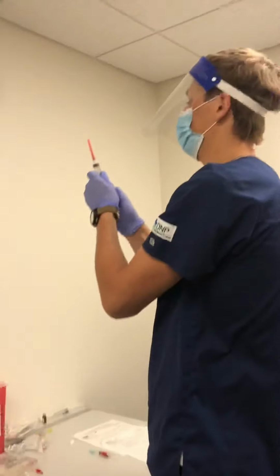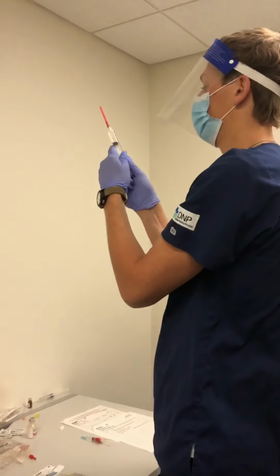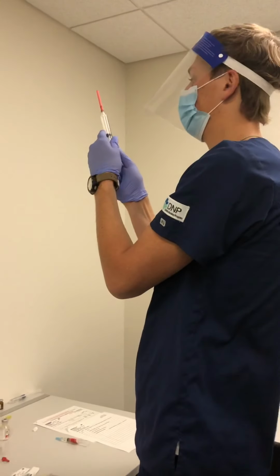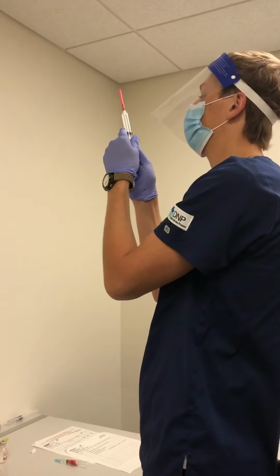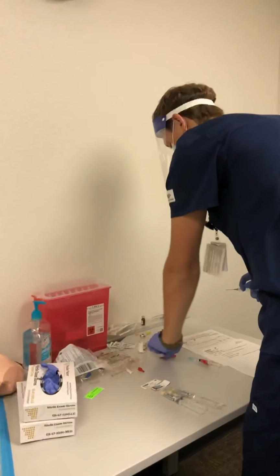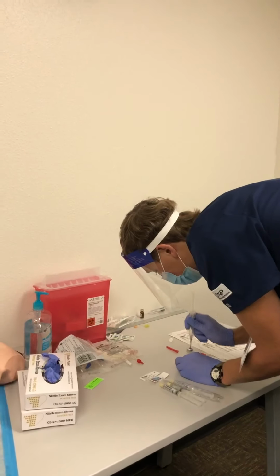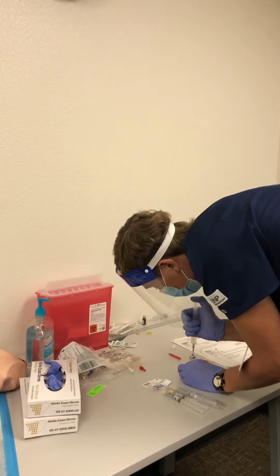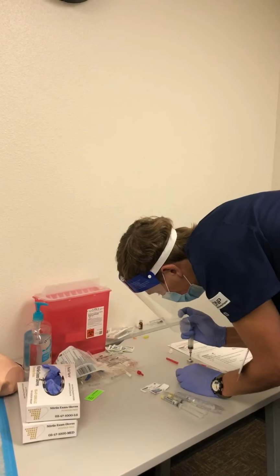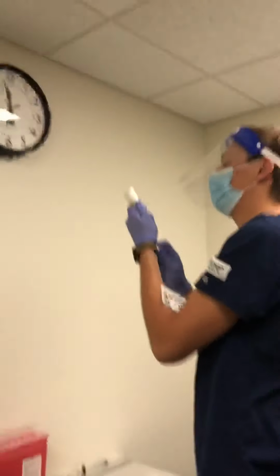Pull my 10 mL. Cap. So that's fully dried now, so now I can instill the air and take out the medication. Invert.